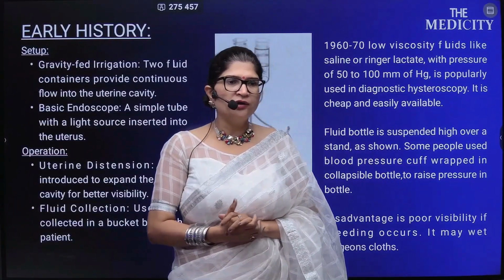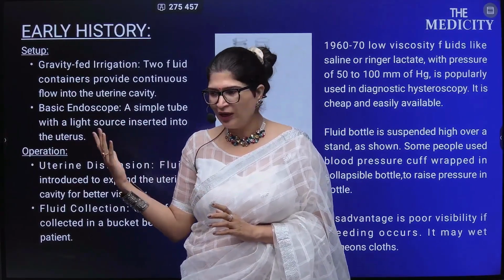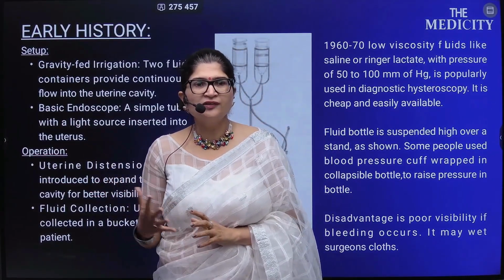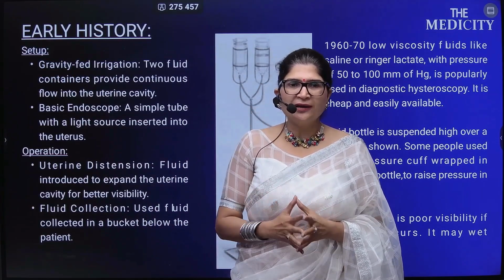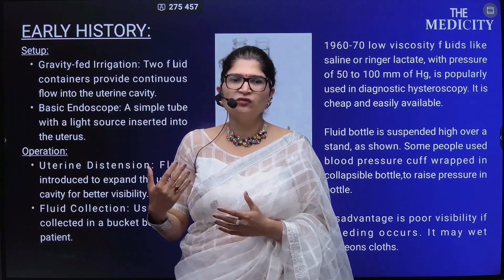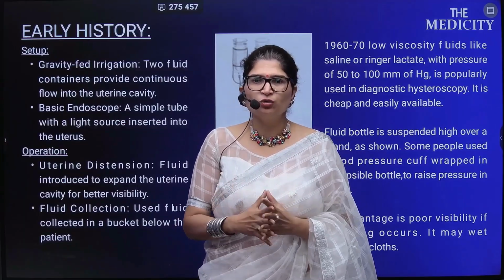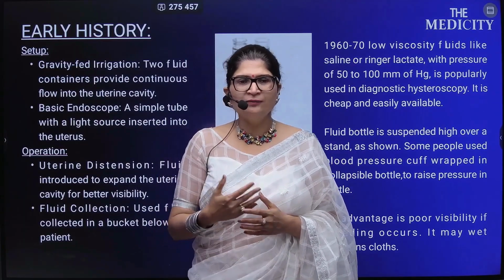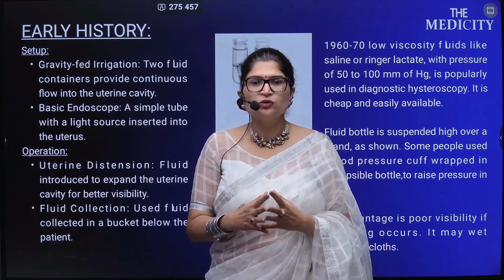Moving ahead on hysteroscopic procedures, the history, as we have already seen: the setups in the earlier days were like gravity-fed irrigation, with two fluid containers used to provide continuous flow into the uterine cavity. This was the ancient system which was being used, and over time the basic endoscopes were invented, which is a simple tube-like structure.